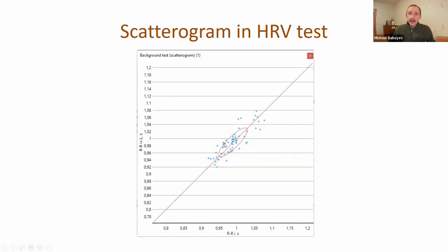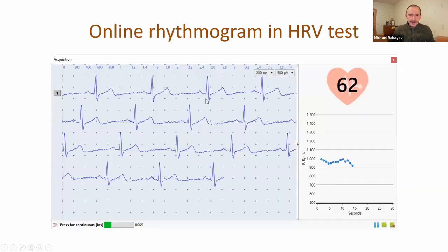Also, we added a scatterogram and an online rhythmogram in the heart rate variability test. When you record an ECG signal, you will see the rhythmogram in real time. You can also see the heart rate calculated at the end of the ECG signal.